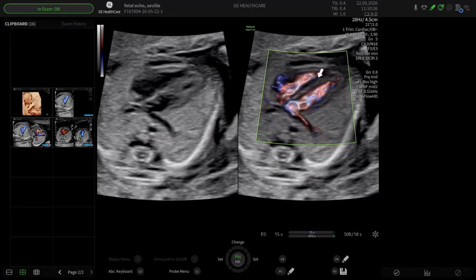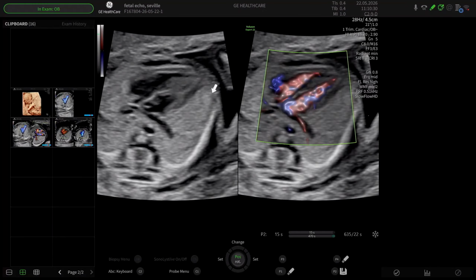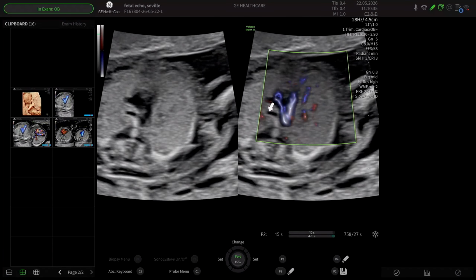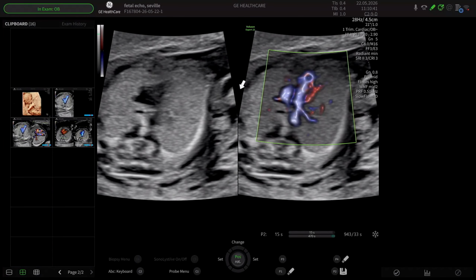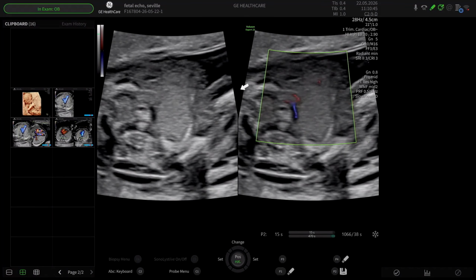And here you can see the interventricular septum and the fill of the ventricles. And as I sweep up from this four-chamber, then up to the three-vessel, you can see I'm getting the branch pulmonary arteries as it exits out of the right ventricle and then continues superiorly the arterial duct. And as I do so, I then move up to looking at the subclavians.